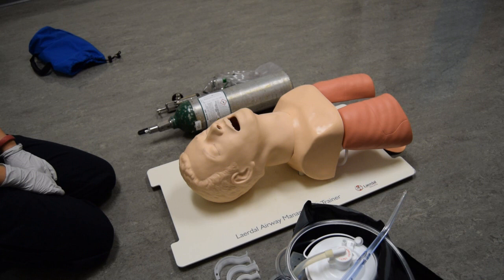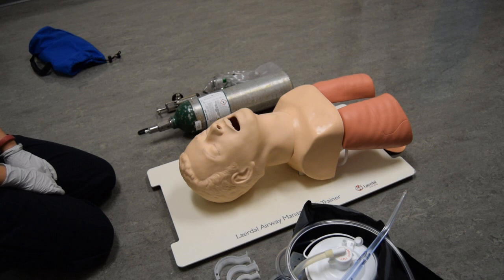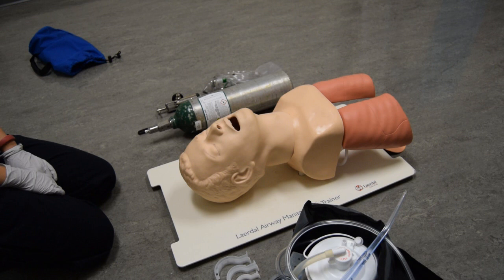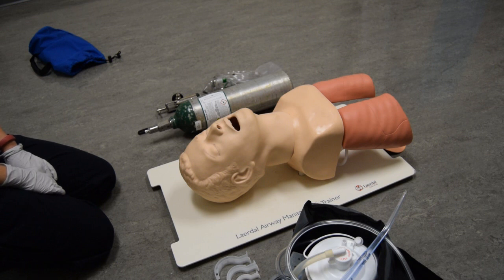I will serve as your trained assistant and will be interacting with you throughout this skill. I will correctly carry out your orders upon your direction. Do you have any questions? No.